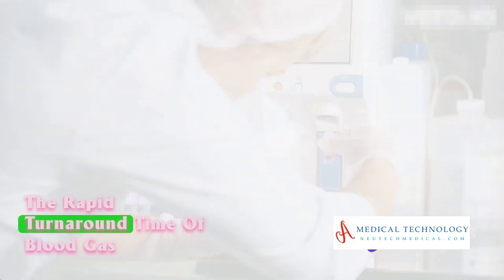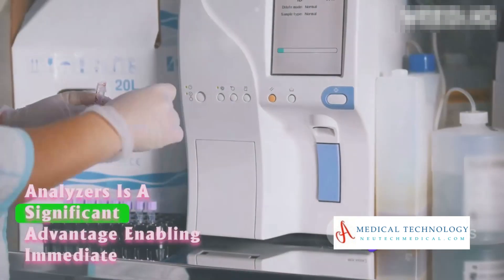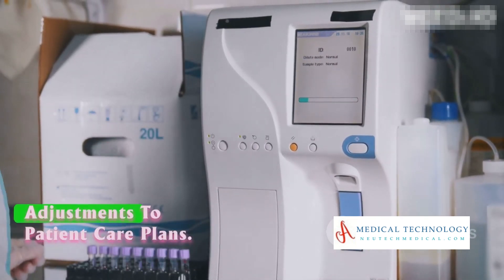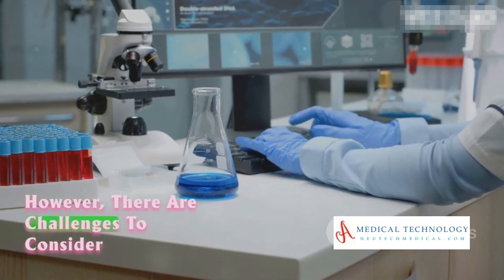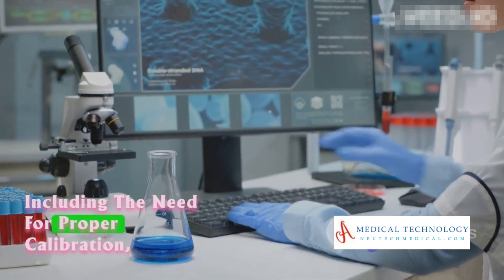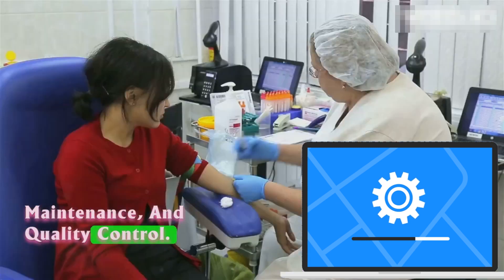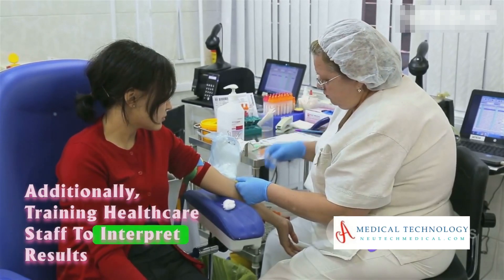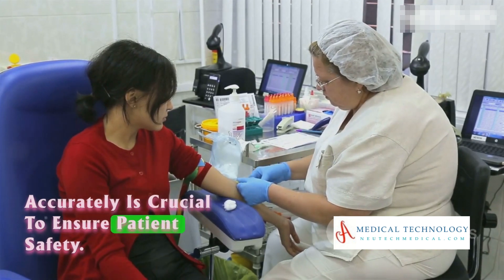The rapid turnaround time of blood gas analyzers is a significant advantage, enabling immediate adjustments to patient care plans. However, there are challenges to consider, including the need for proper calibration, maintenance, and quality control. Additionally, training healthcare staff to interpret results accurately is crucial to ensure patient safety.